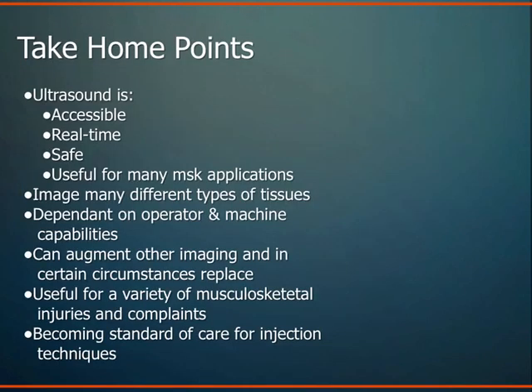So, take-home points for MSK ultrasound. A lot of benefits for this modality, especially in the world of MSK and sports medicine: real-time accessibility, very safe, and a lot of applications for MSK imaging.